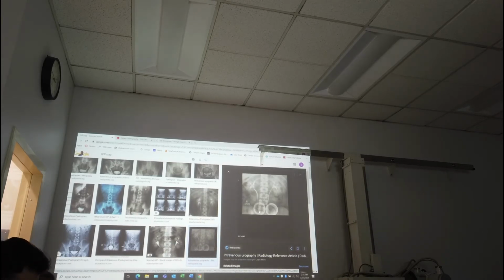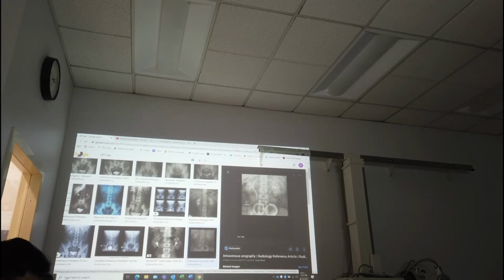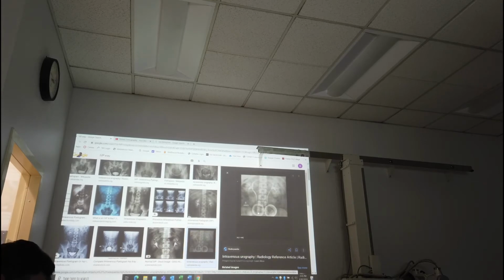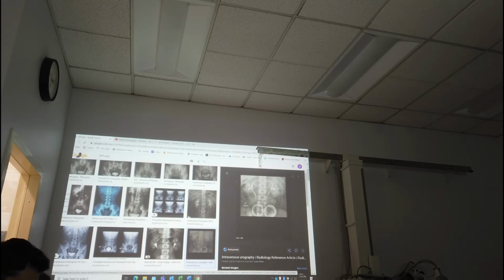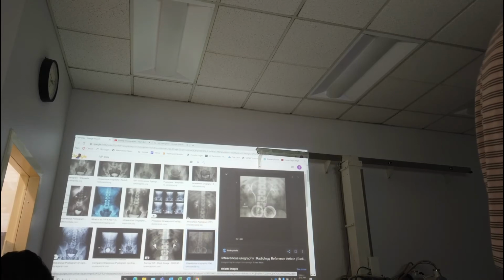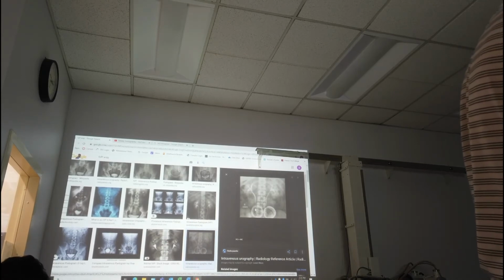And then they have this plexiglass board. It's hard. They'll put it across, and then they'll put a belt around the patient and strap it on, so it's kind of putting pressure. And then they'll pump up those bladders, so it's applying pressure in that area, and it's keeping the contrast from draining all the way down into the bladder. So you can see the contrast kind of stops right here and right here, right? That compression is keeping it from draining into the bladder.